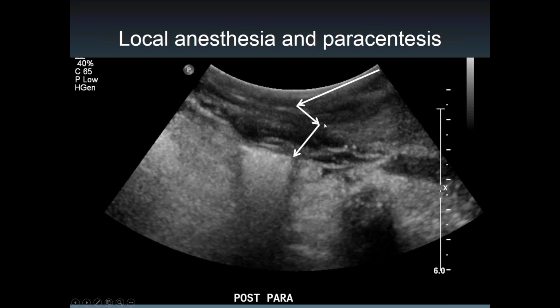That helps you to minimize the risk for a fluid leak. So you're going like this, and then you angle your catheter this way and then this way, or just one angle is also good enough. It's better than no angle to just artificially increase your trajectory.